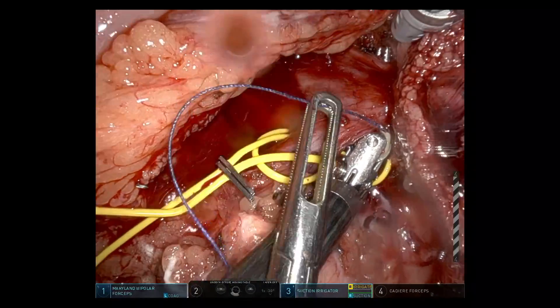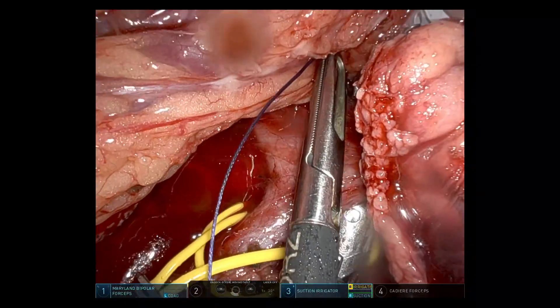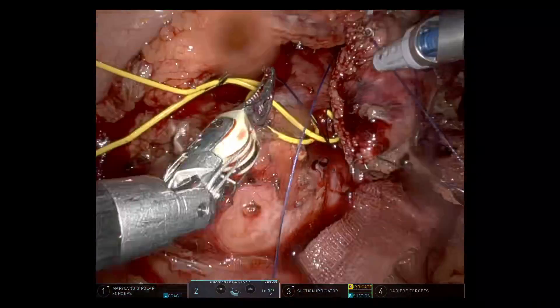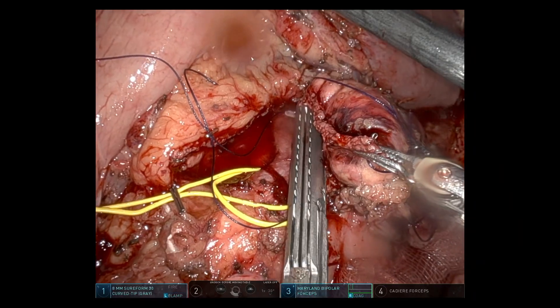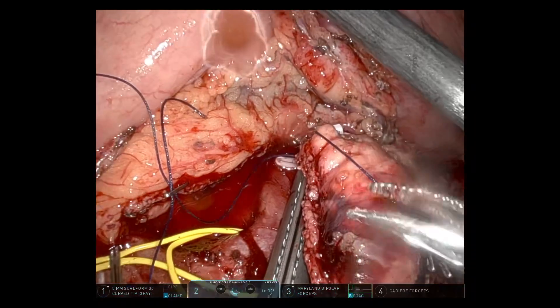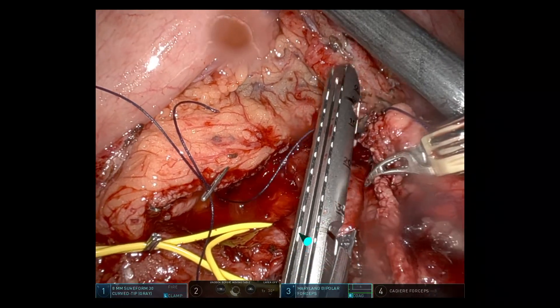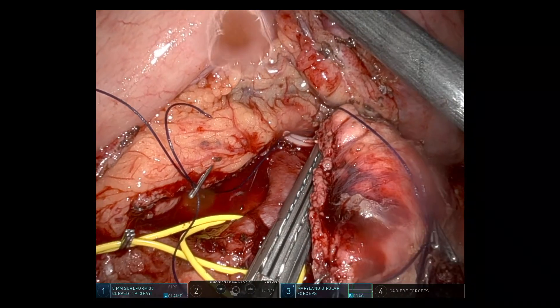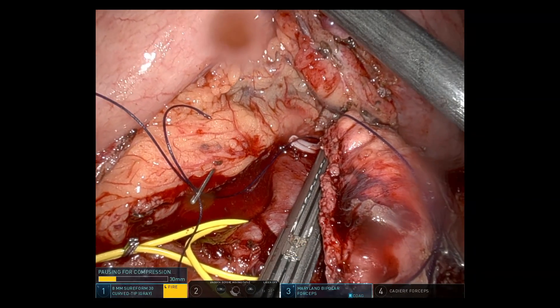Getting another tie around the splenic vein where it inserts into the sidewall of the SMV and portal vein. I opted for a 30mm stapler with a vascular cartridge — I felt I had enough of a cuff without narrowing the SMV-portal vein significantly.